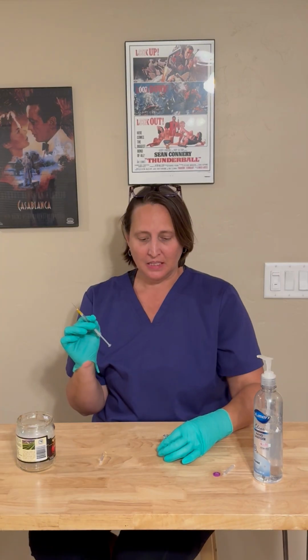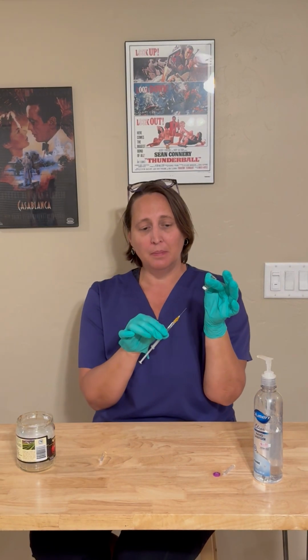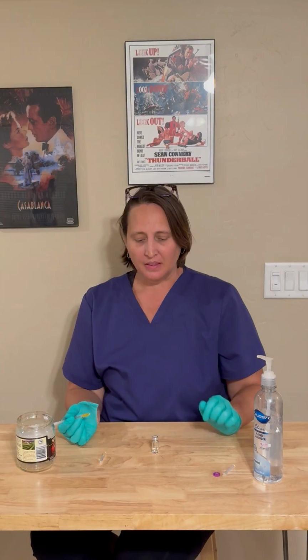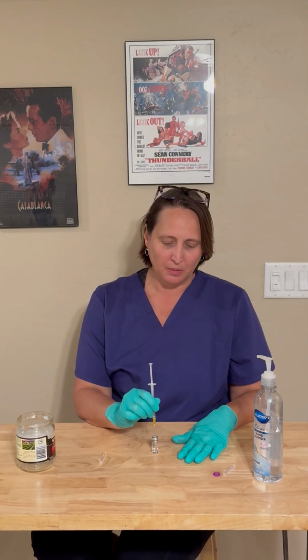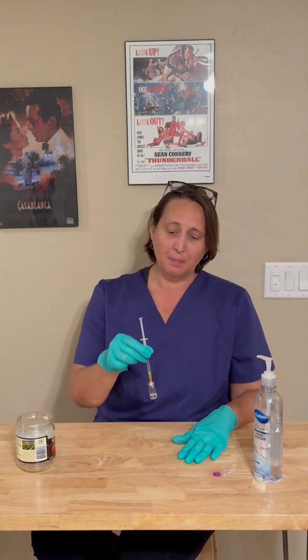It's been 10 seconds and the stopper is now dry. A lot of nurses will invert and put the needle in the rubber stopper like this. This increases your chances of a needle stick. So you'll want to keep the vial on a flat surface. In the very center of the rubber stopper is a bullseye. You'll take the needle straight up and down and gently push it into the center of the vial, in the middle of that bullseye. Once the needle is in the vial, you can then pick it up and invert it.